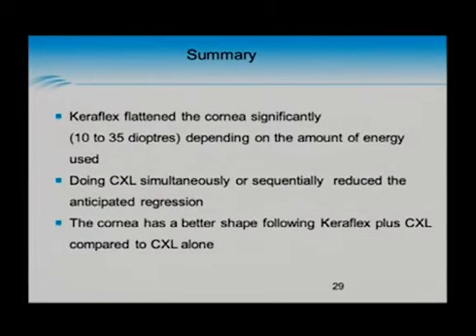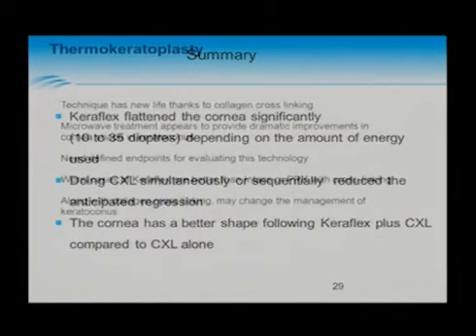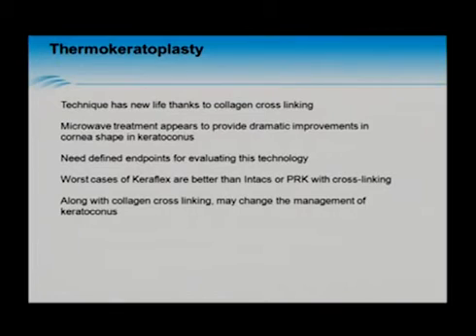So in summary, Keraflex can produce tremendous flattening and regularity to keratoconus corneas. Whether we should do the cross-linking at the same time or later is not clear, but cross-linking is essential in making this work. And not only is there flattening, but there's a better corneal shape after this combined procedure.